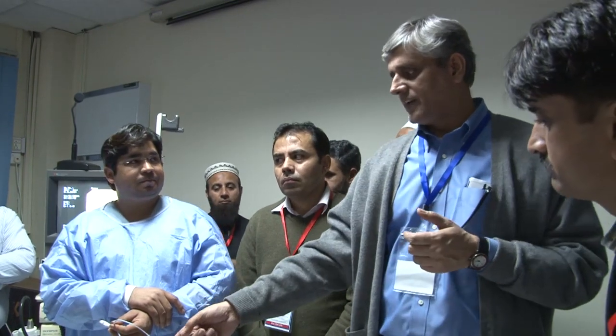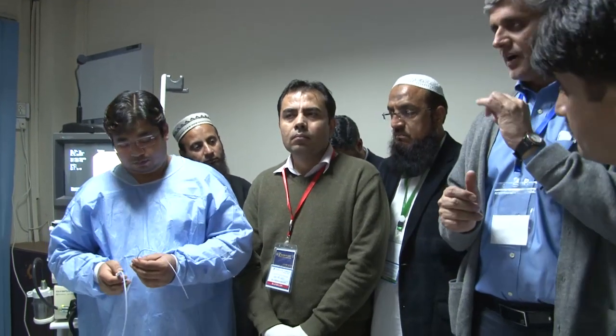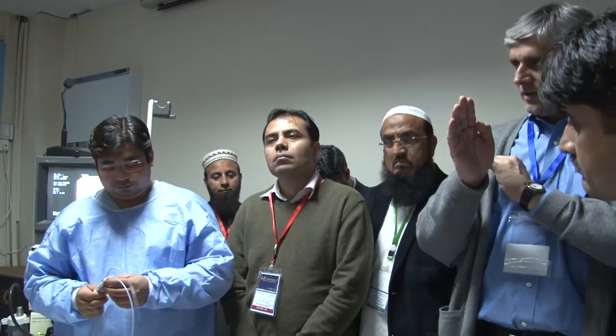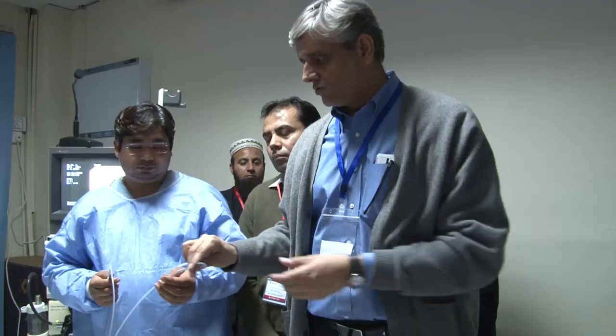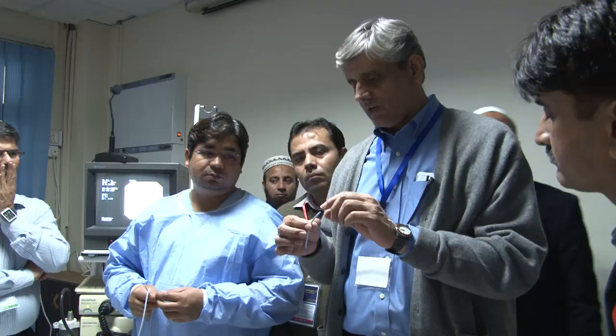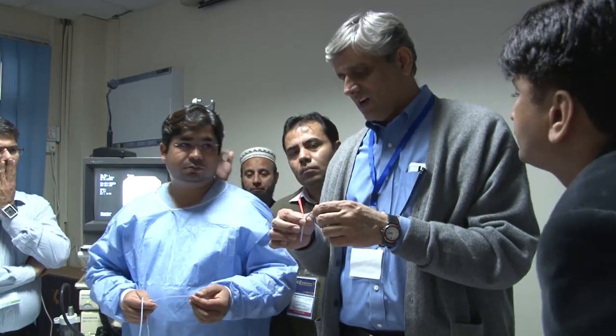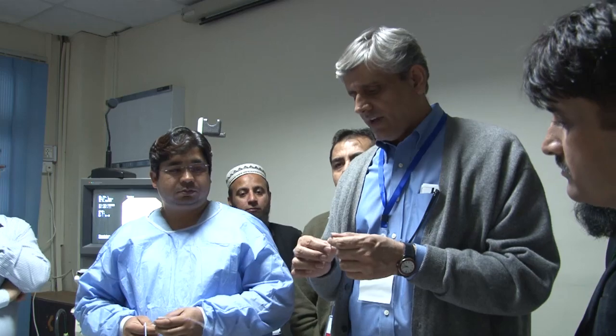तो ये जो स्टेंटिंग में मैंने लोगों को फंसे देखा है, उसकी सबसे बड़ी वजह ये होती है कि आप पुलिंग बैक एंड एडवांसिंग की टेक्निक को यूज नहीं करते. As long as you do that and you understand that, make sure that your attendant, your technician knows कि कौन सी साइड ऊपर जानी है. ठीक है ना? The stent has a slightly more narrow and tapered end that goes in. ठीक है?